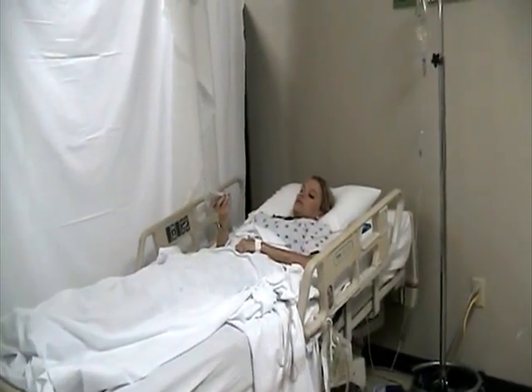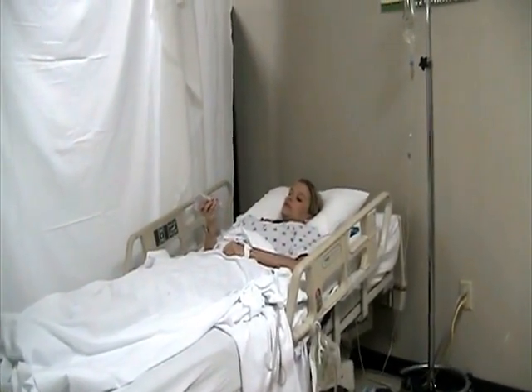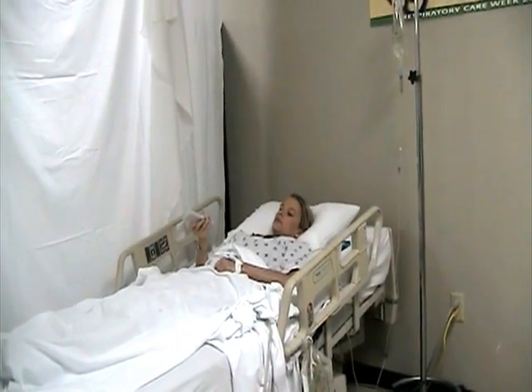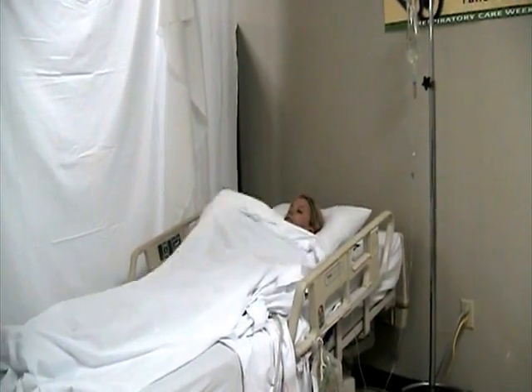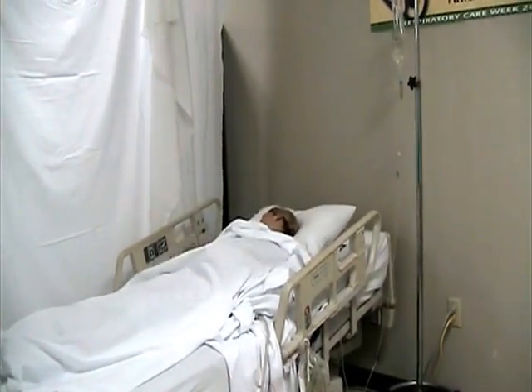Our first video will show how to transfer a patient from bed to wheelchair. The second video will be how to transfer a patient from the wheelchair back to the bed. Our patient is Mrs. Eda Monroe.